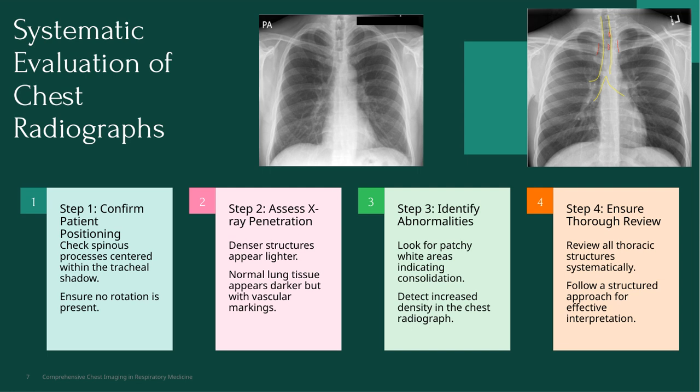Finally, it's essential to review all thoracic structures thoroughly. Following a structured approach ensures we don't miss anything important. Systematic evaluation like this is key to accurate interpretation and ultimately, better patient care.